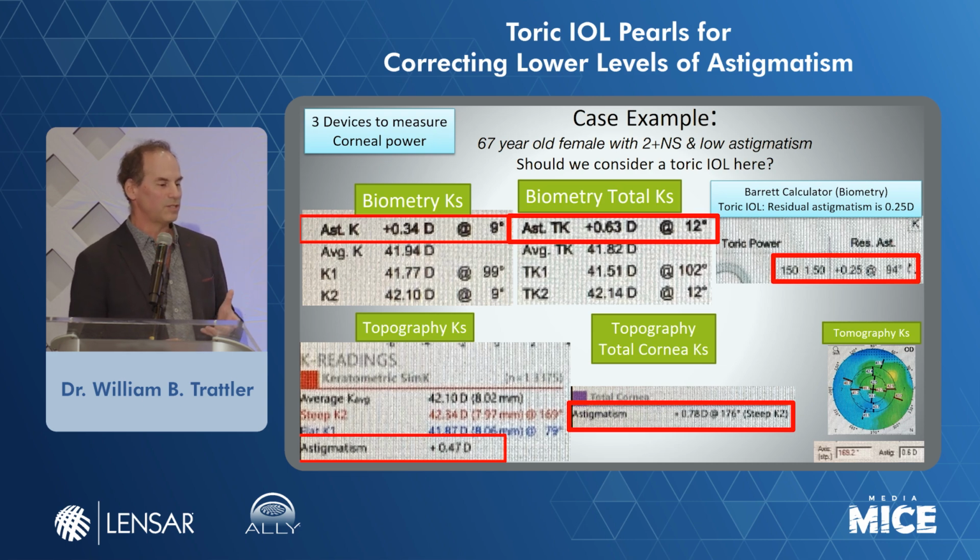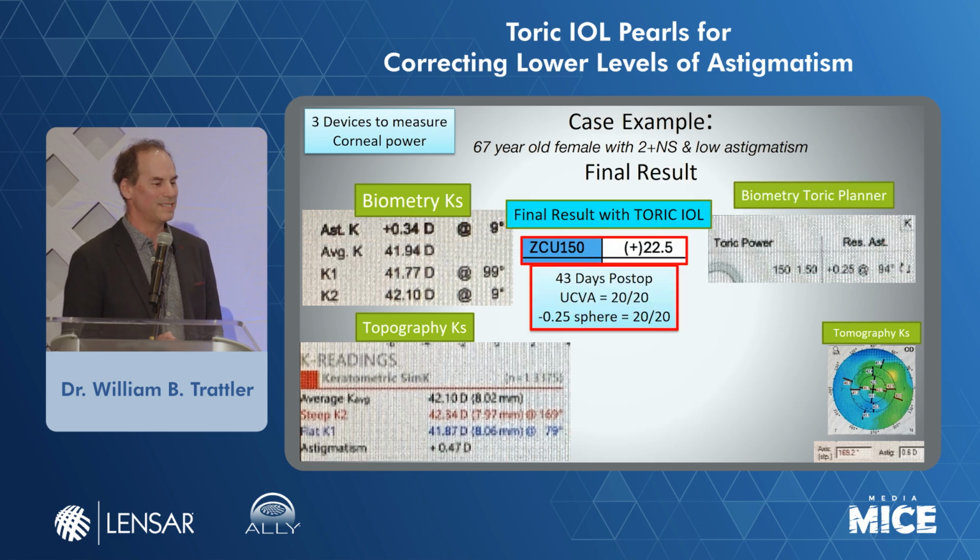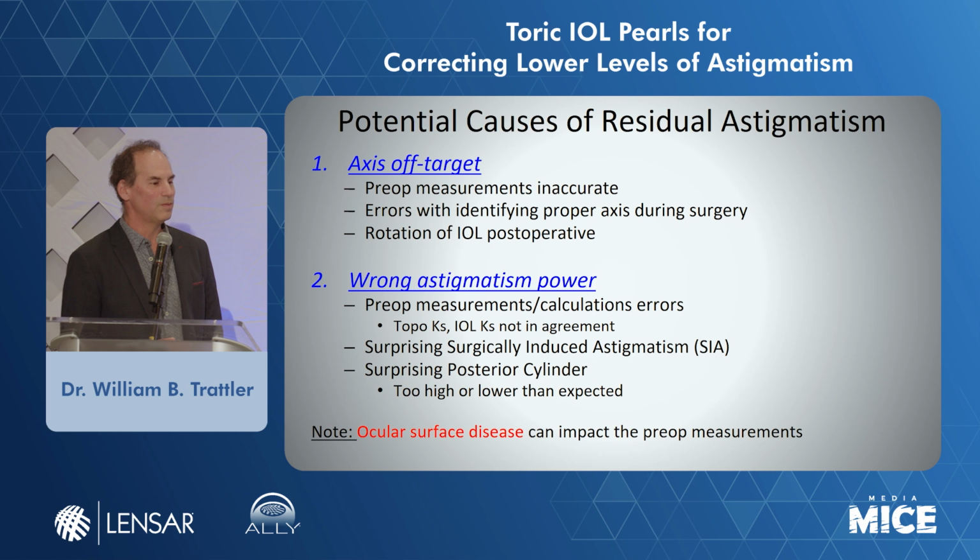So here, I felt using a toric lens would be helpful because our goal is to get as close to 0 as possible. And I'm personally not a fan of AKs because of dry eye and other issues. So again, I like to use toric lenses in this case. And this is how our patient did. We did end up using the J&J lens. Sometimes there are differences in the nomogram; it said we should have flipped the axis a bit. In refraction, we did not, but overall, you see the patient did quite nicely by using a toric lens in this case. So again, there are lots of reasons it could be off axis.